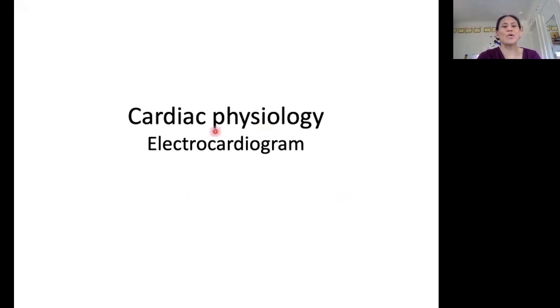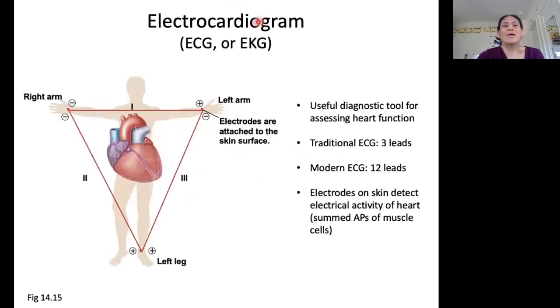In this video, we are going to be talking about the electrocardiogram. The electrocardiogram is abbreviated ECG or EKG, based on a German spelling of the word. And it's a useful diagnostic tool for heart function. The way it works is this.